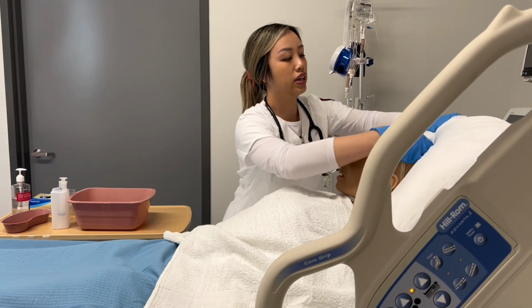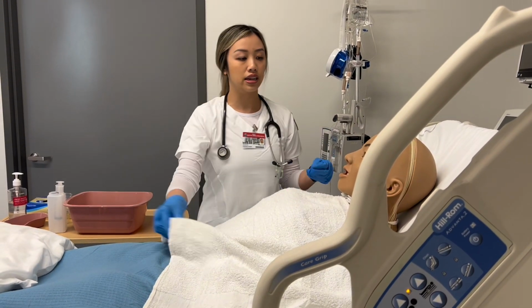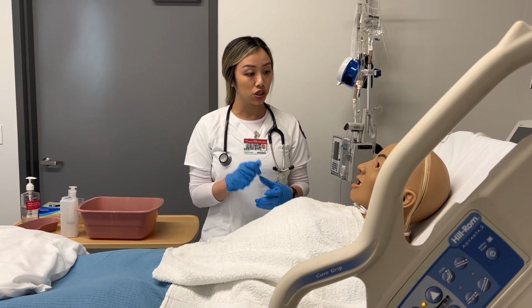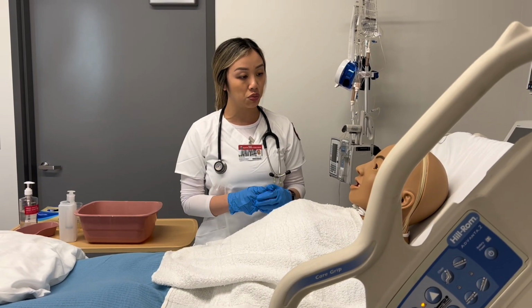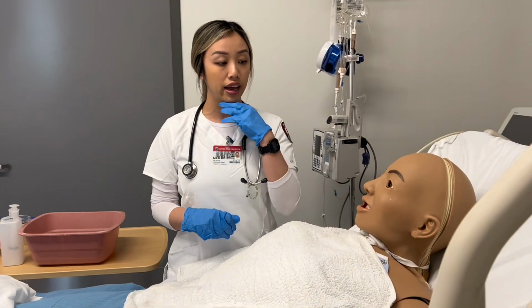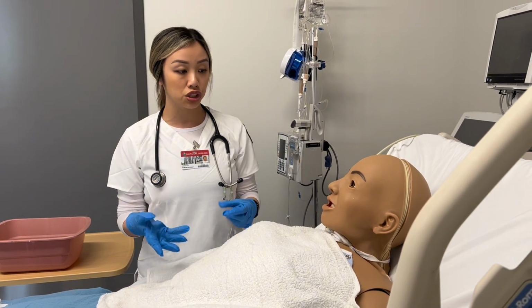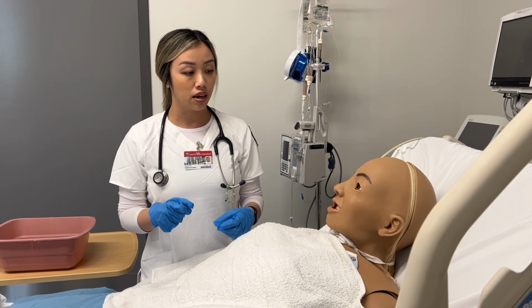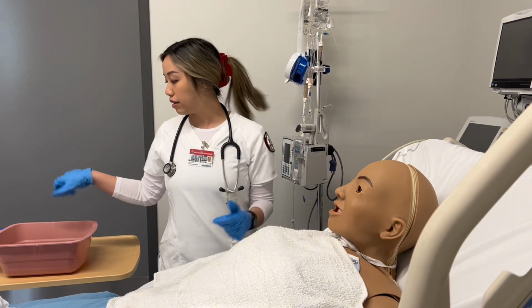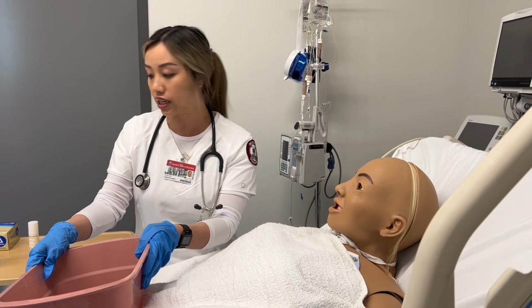Okay, and then go ahead and lift your head for me, sir. I'm going to further explain the procedure to the patient. When we insert the tube, I'm going to let you know when to tilt your head back. And then there is going to be a point where I'm going to tell you to tilt your head from chin to chest forward. I also have a glass of water here, and I'm going to instruct you when to take a sip every single time I advance the tube. But I'll let you know when that happens, okay? I'm also going to give you this bin here. This isn't mandatory. It's just in case you need it.